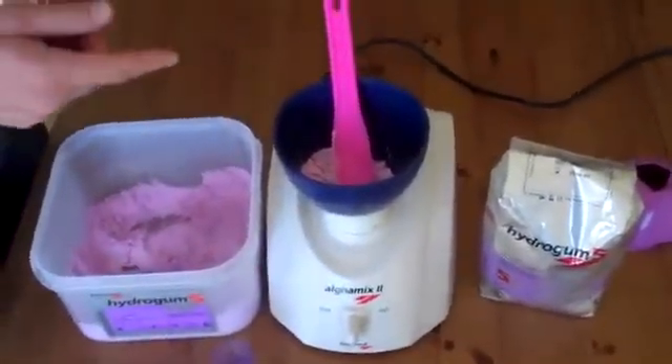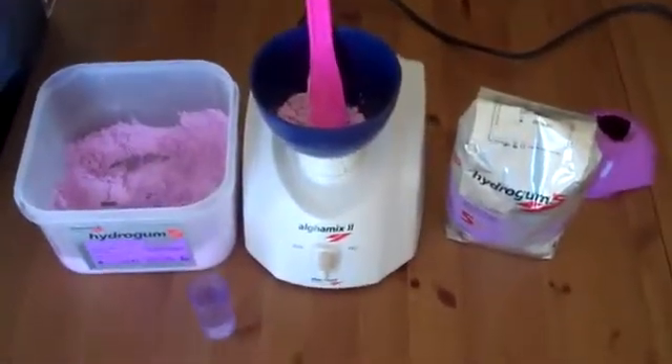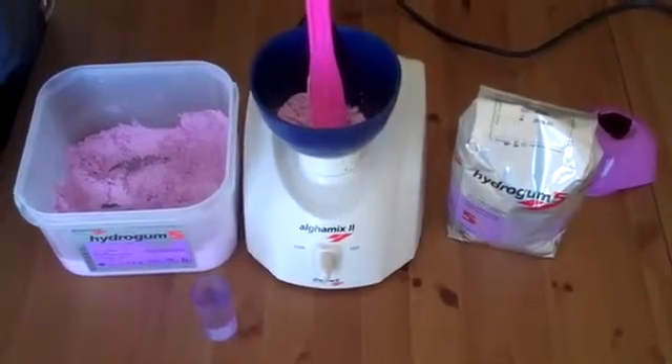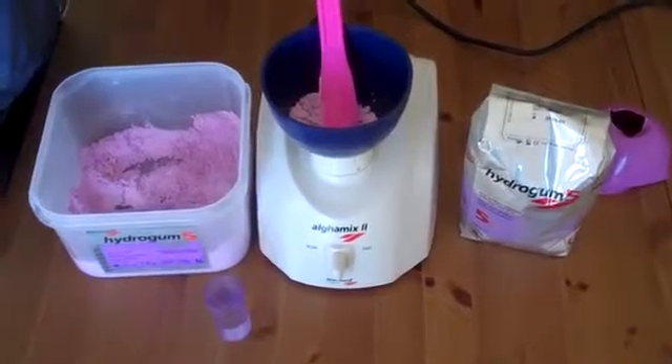Today I wanted to introduce you to a little machine for mixing alginate. As we know, if you get the impression wrong, then everything else is not worth doing. So we really know how important it is to get the impression right.